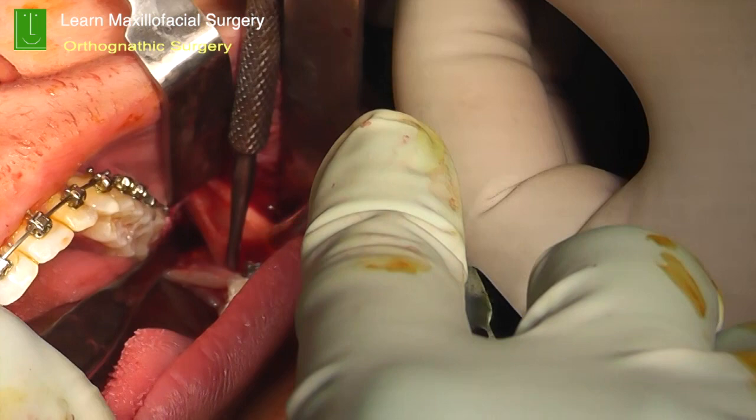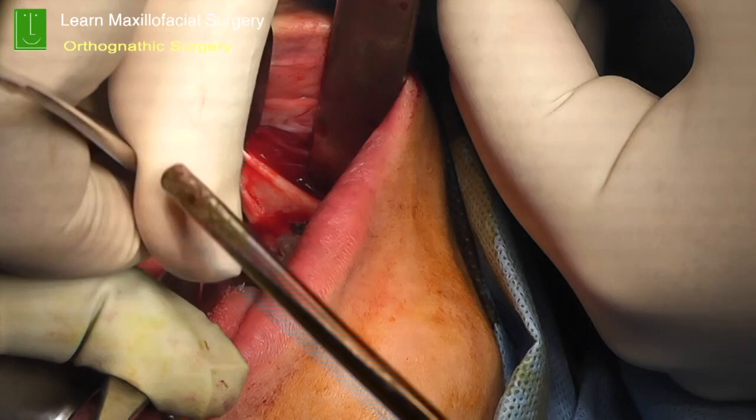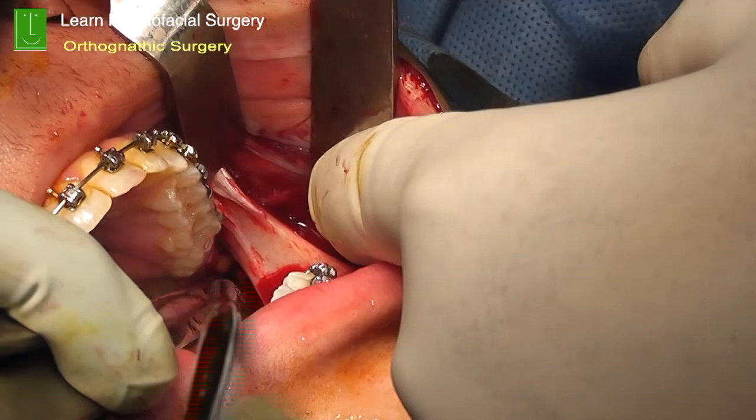Dissecting the soft tissue and making sure that even in the wisdom tooth area, you're basically in a subperiosteal plane is the key. Occasionally you might get some fat there. Fat comes in the buccal side as well as on the lingual side in the pterygomandibular space, and that can be very easily dissected out, and that's what we are doing over here.